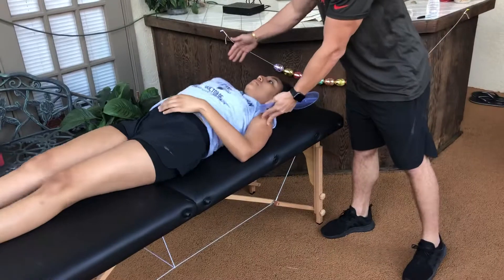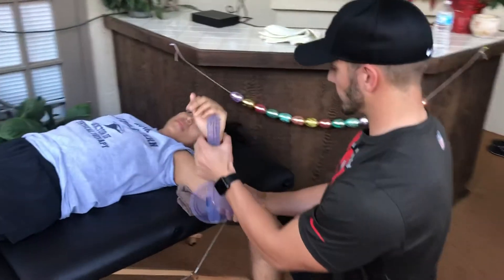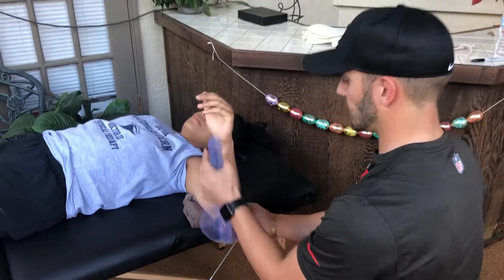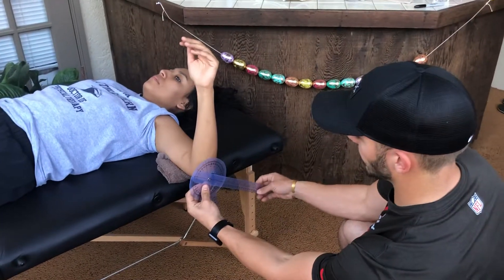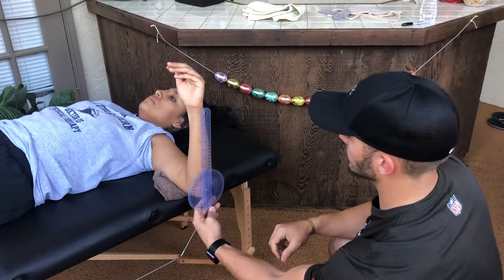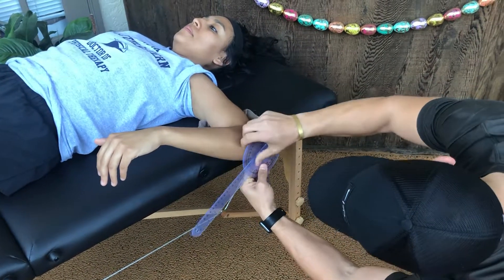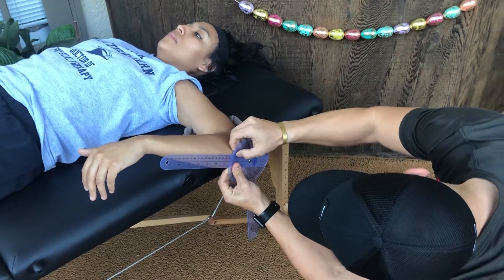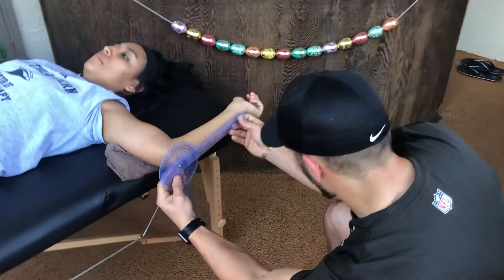I'll have you shift to the side a little bit for me. I'm going to place the towel back underneath the elbow. I'm going to do internal and external rotation. Internal rotation is going to be like so. My axis of rotation is going to be the olecranon. The stationary arm is going to be perpendicular to the floor, and the moving arm is going to follow the ulnar styloid. Can I have you move forward into internal rotation, as far as you can go? And I have 65 degrees — the norm for this is 70. Now I will do external rotation, which is going to be backwards. Same landmarks. And I have exactly 90 degrees, which is the AOS norm. Thank you.